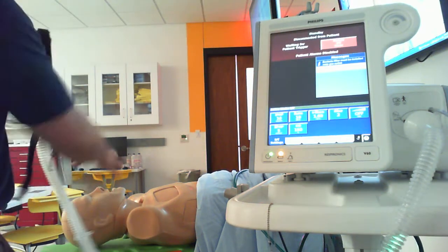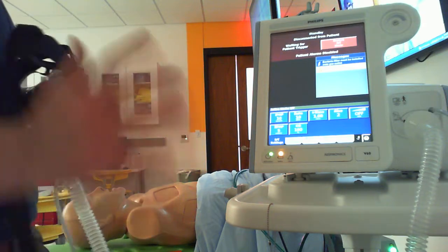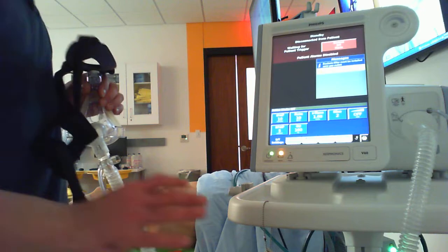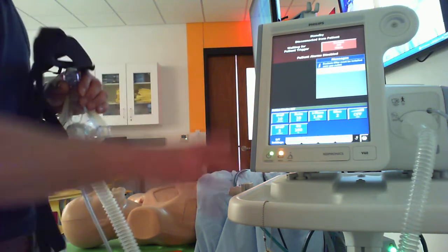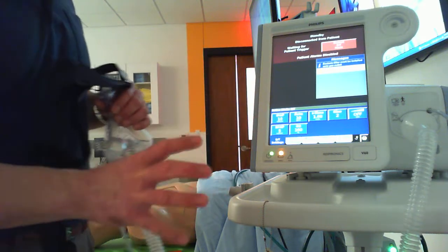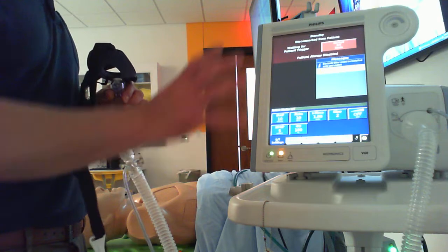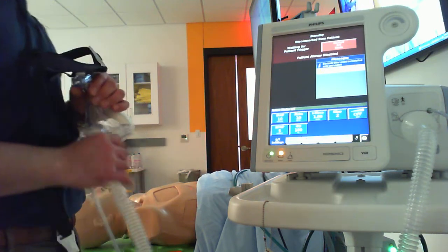So I'm going to go ahead and apply it on the face, but once again, you could always hit restart if you're concerned about that. What I'm going to do is explain kind of how this is going to work for this patient. I'm going to hold this up to their face and kind of let them get accustomed to it, all right? At the bedside, I may be actually holding the mask on and quickly making changes to their settings before I strap them in. But for the sake of simplicity for this video, I am going to get them strapped in, and then we'll talk about adjustments and stuff after the fact.